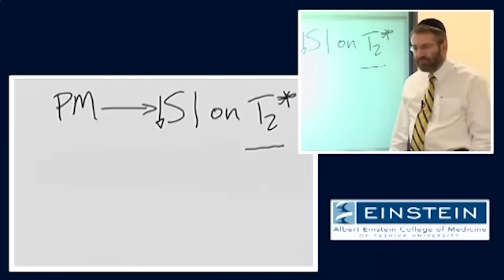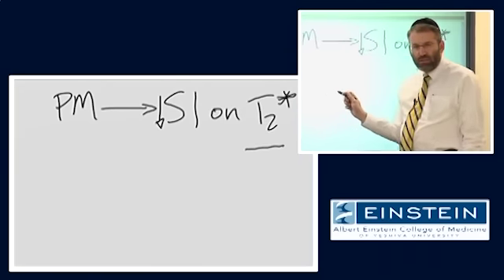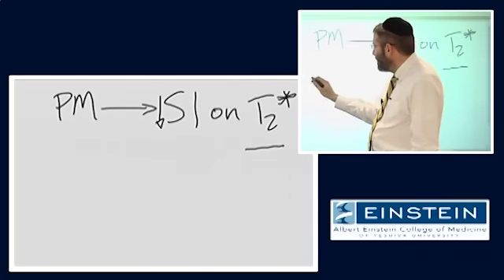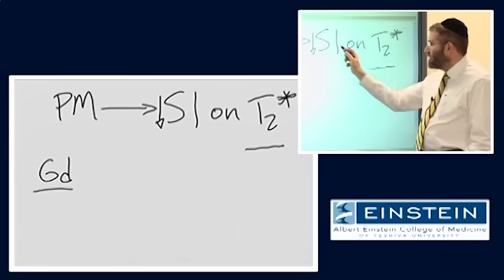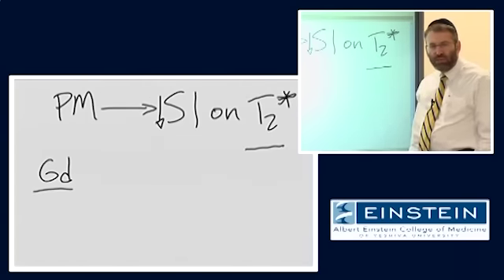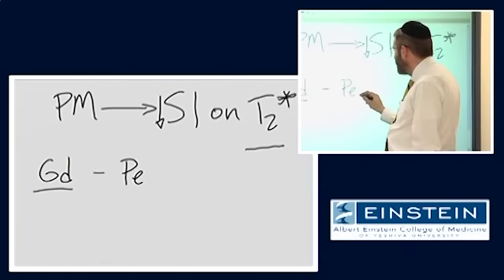So what I want to talk about now is inducing this effect by injecting a paramagnetic substance, right? Gadolinium-based contrast agent, to deliberately cause this type of signal loss and to use it to extract some diagnostic information, specifically some information about physiology. And this is about perfusion imaging.